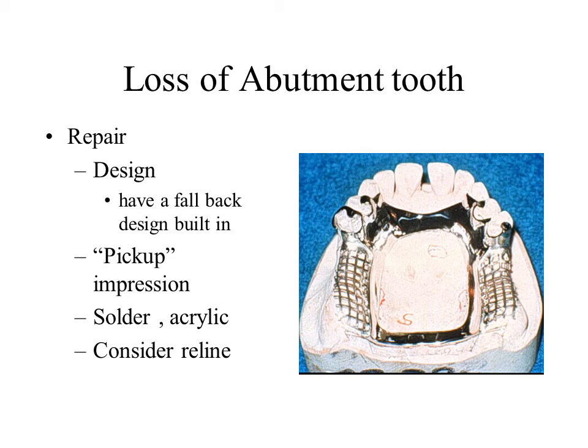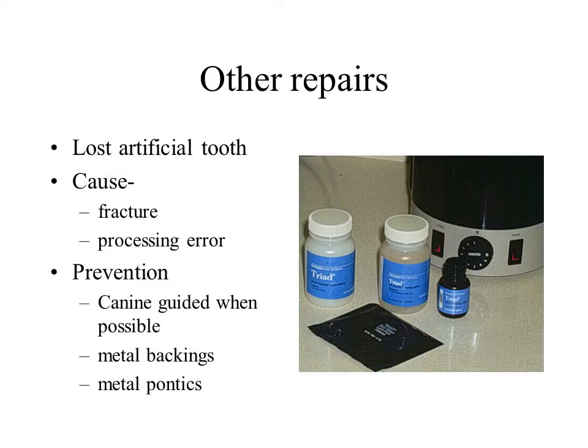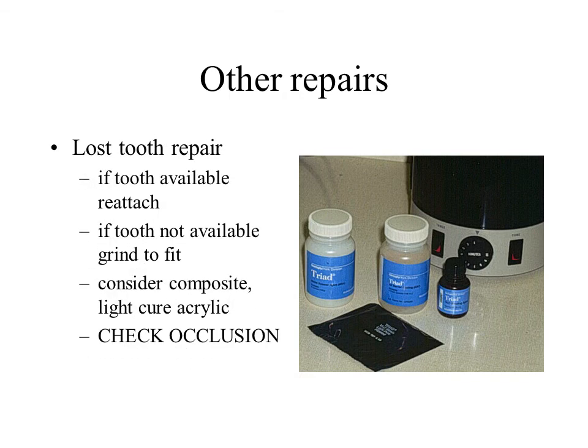The ability to repair the partial denture must ultimately be determined by the person actually tasked with doing the repair. It is usually wise to consult with a dental laboratory technician as to whether or not the RPD may be repaired, and what is needed to facilitate the repair.